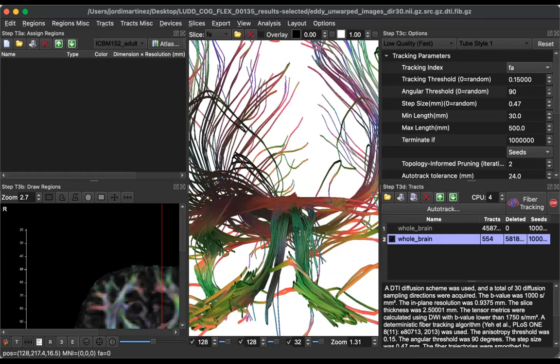So that's why in this case, if you can find the anterior commissure and quantify it and compare it to the normal controls, it might be thicker, or it might have greater FA. I'll look up papers for how to isolate that. Yeah, that would be good. Because we didn't do it for that patient because it was severed, so there's no point. But here, there is a point in looking at it. Yeah, that makes sense.